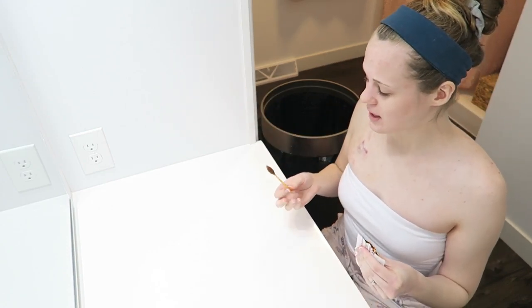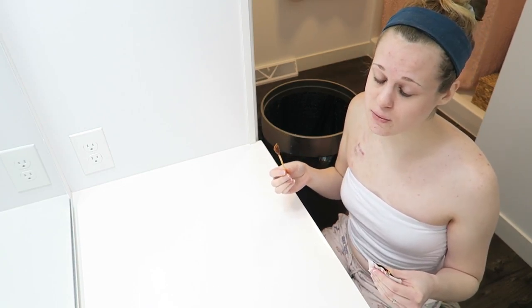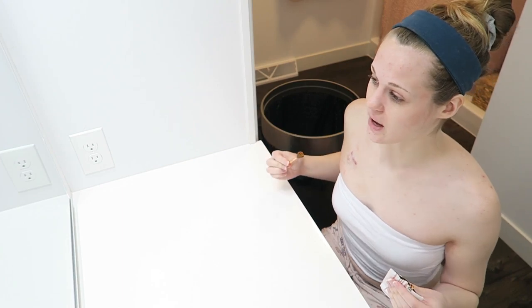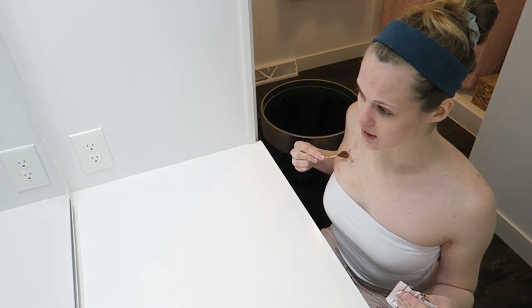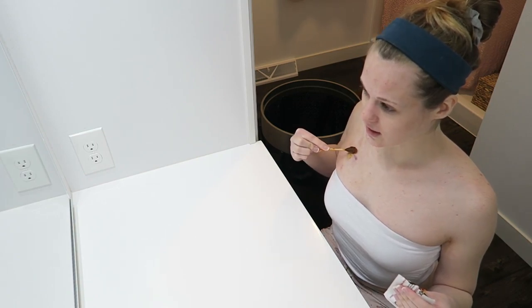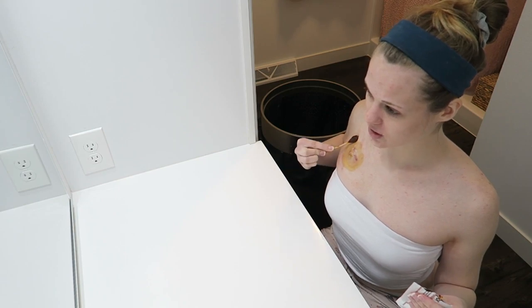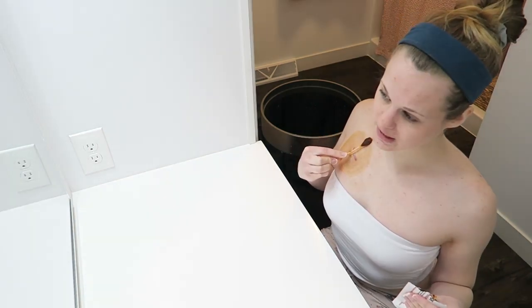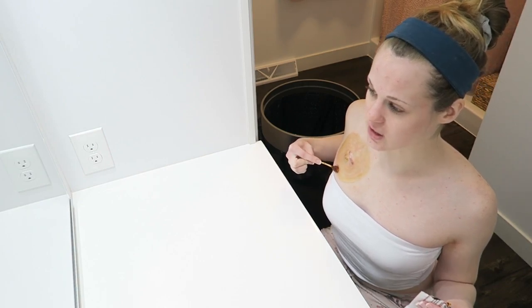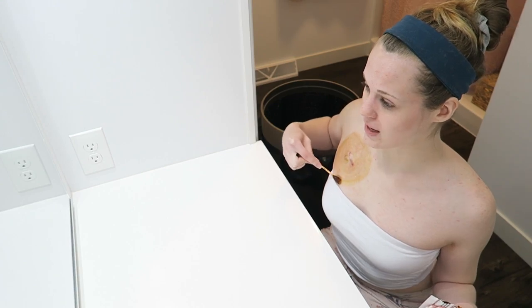And what I'm going to do, this is how I've been taught. There are different protocols depending on what hospital you use, what nursing company, etc. I start in the middle and I scrub it. And then in circular motions, I go around the port going outwards. You don't ever want to go outwards to inwards because then you are spreading the bacteria towards the port, whereas this way you are spreading the bacteria away, which is what you want.